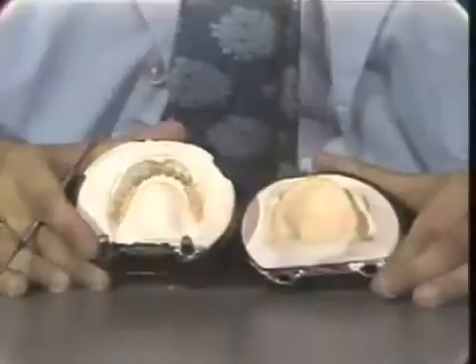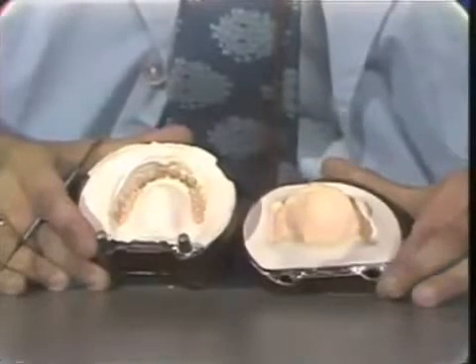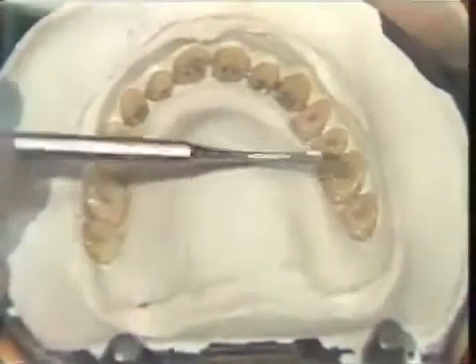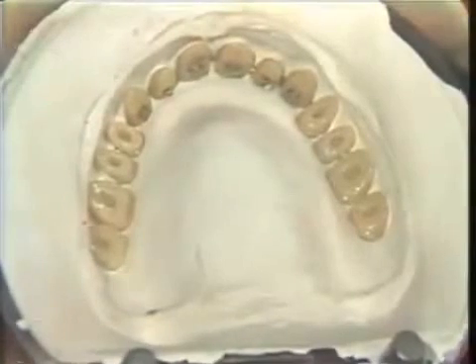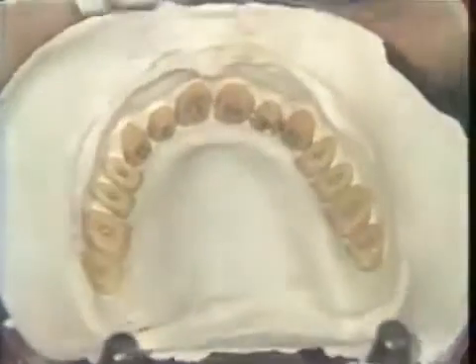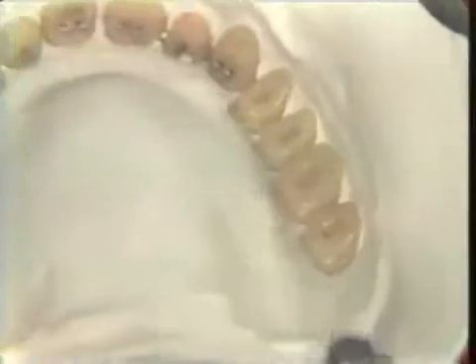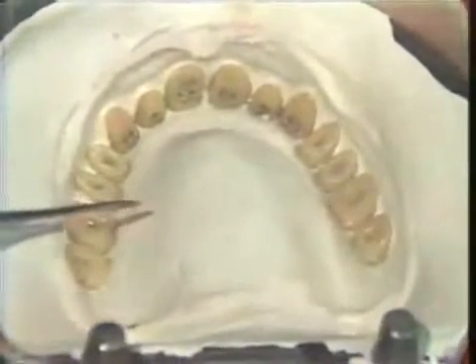I'll be back in just a moment and we'll show you what these molds look like after they're cool. You now see the top and bottom of the flask with all of the wax and base plate removed. If we come in close, you'll see that the contours you were so careful to carve in your wax are now reproduced in the Yellowstone and model plaster mixture, which is the second pour that you made in flasking the denture, and you can see there are no traces of wax. The porcelain teeth have spaces built into them as retentive areas, or diatoric spaces. When we use acrylic teeth, we quite frequently will drill a small hole on the underside of the tooth as a retentive space.